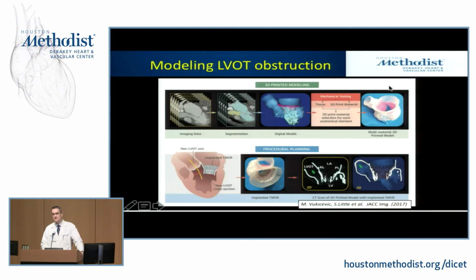Where we're excited is in TMVR. You'll hear more about that this weekend. Transcatheter mitral valve replacements. The big concern there is putting in a big device, displacing the anterior leaflet into the LVOT and causing LVOT obstruction. One way to practice for that and try to avoid it is to create models, so we've been doing that. This is a device implanted in a patient-specific model, and then a CT of that model to really demonstrate how big the LVOT is for this particular patient with this particular size device.